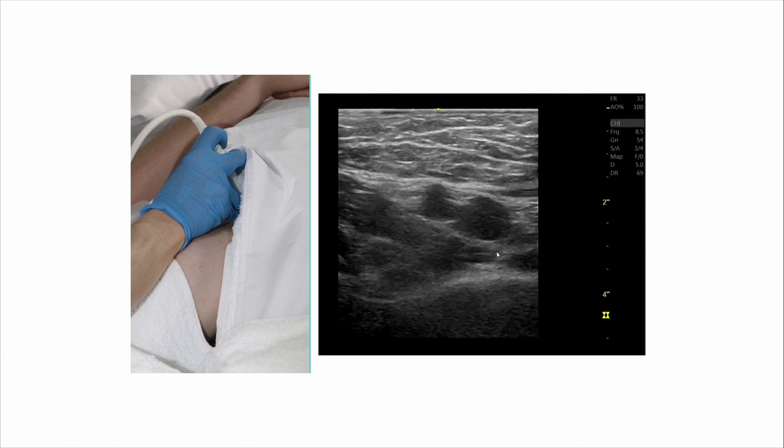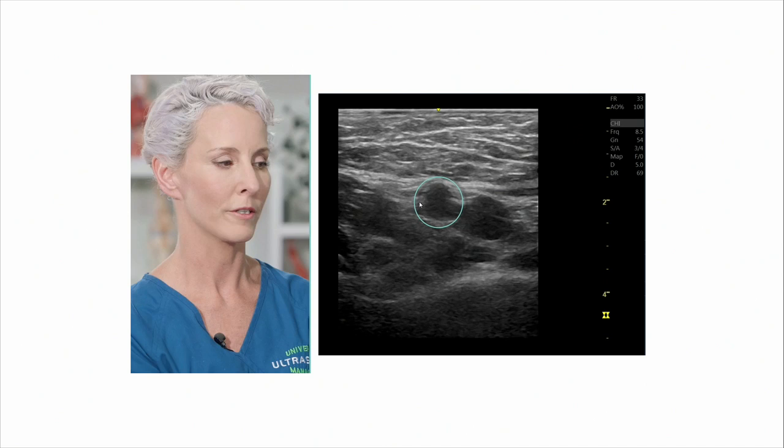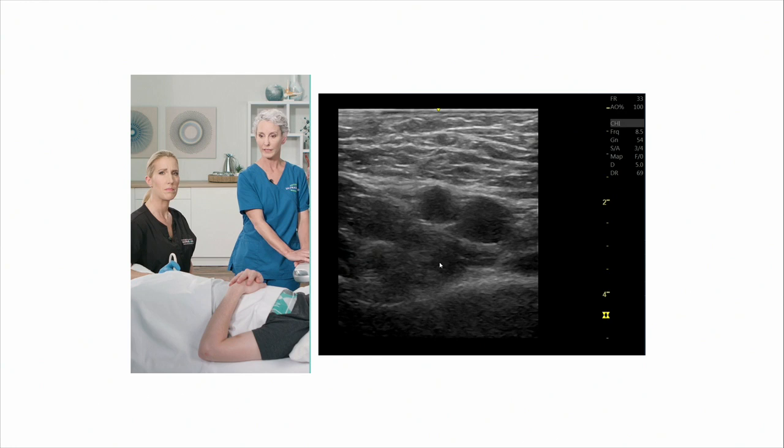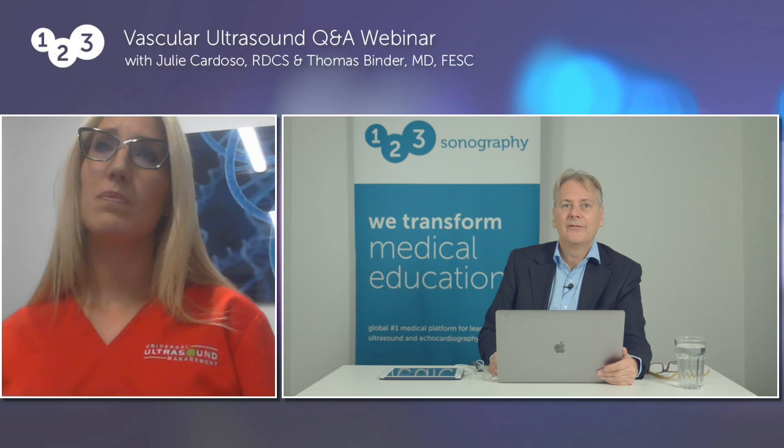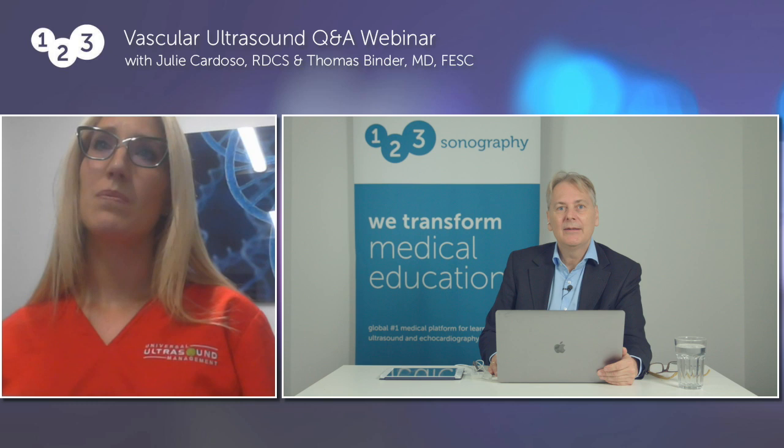Another way to distinguish between the two is to use color — you'll see the blinking of the artery on the left and the waxing and waning of color on the right. Scanning proximally, we can see the femoral head. You also note that the vein is bigger in diameter than the artery. So these are clues you can use during your exam to differentiate between the artery and the vein.